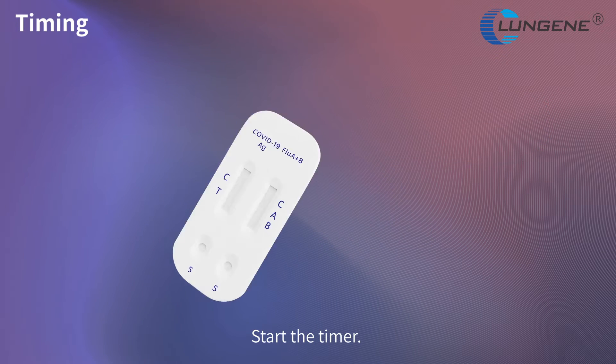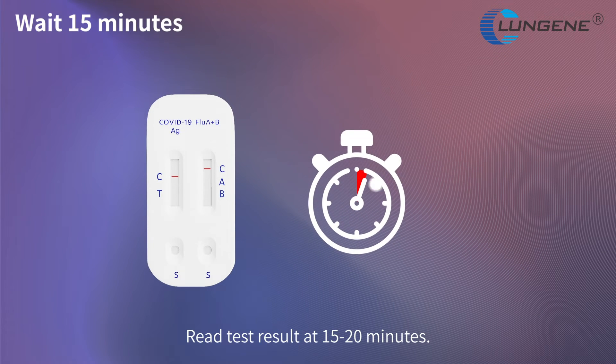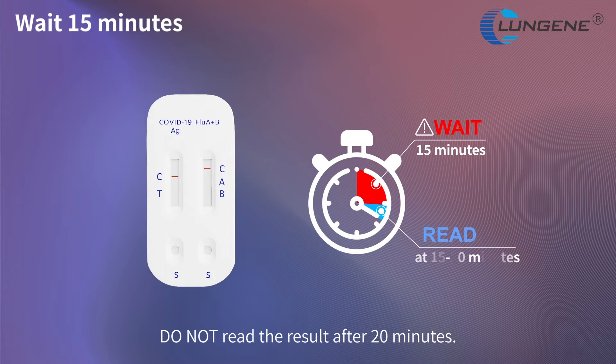Start the timer. Read the test result at 15 to 20 minutes. Do not read the result after 20 minutes.